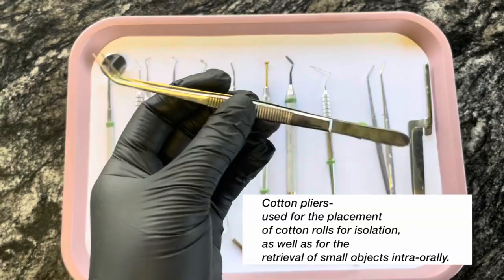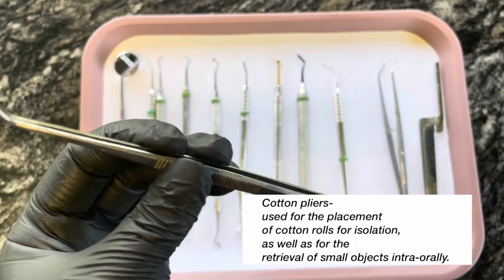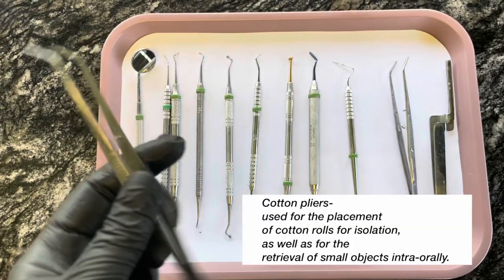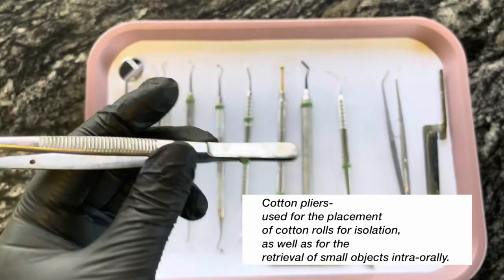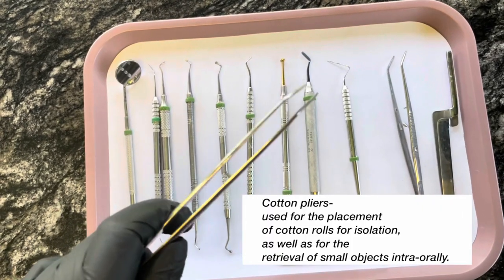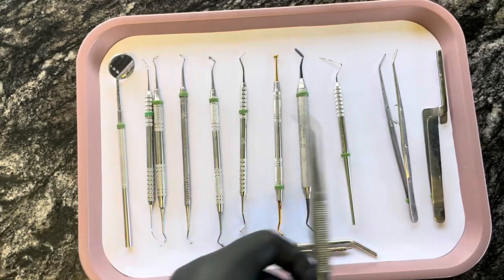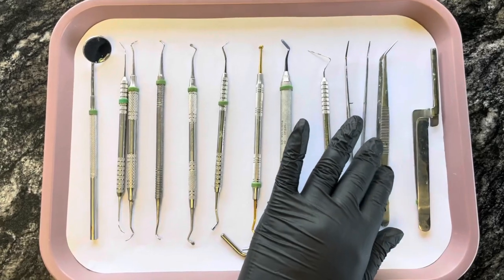Next I have two cotton pliers — one for the assistant, one for the doctor. The assistant one I use to grab things out of my drawers so I don't have to take off my gloves. You don't want to use your dirty gloves to grab things out of the drawers, so instead of wasting time taking off a glove and putting it back on, I just use my cotton pliers. Be sure if you're going to do that, to not use these on anything that came out of the patient's mouth or in the patient's mouth — do not do that. The doctor's forceps are the ones to go in the patient's mouth.